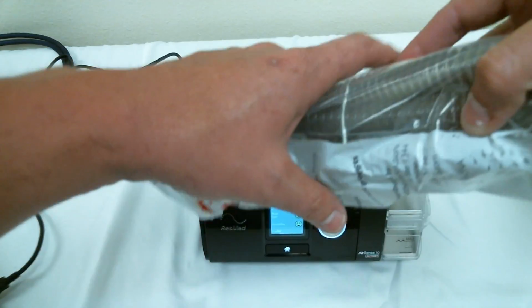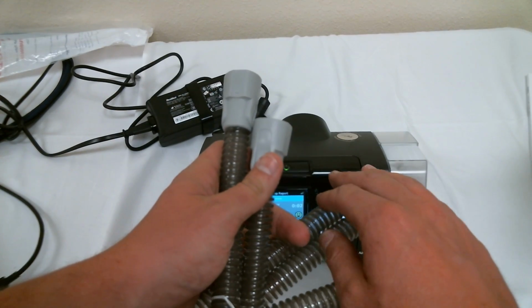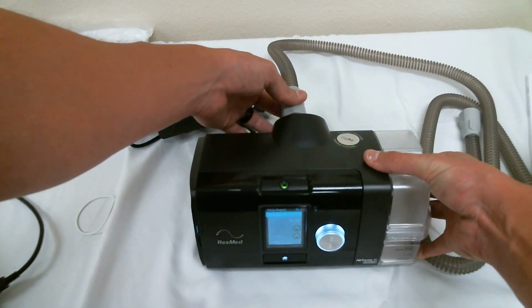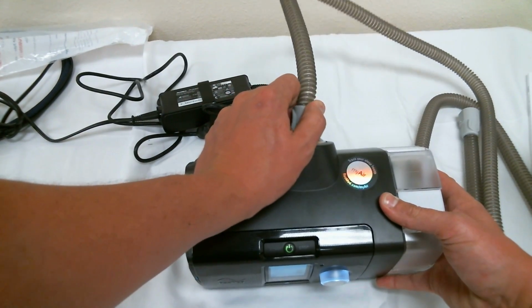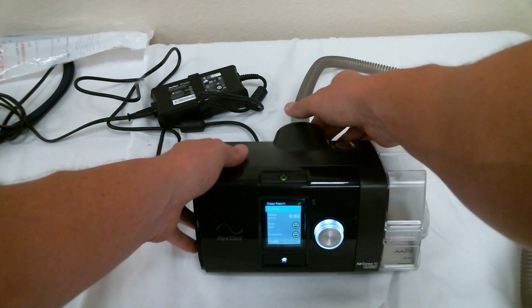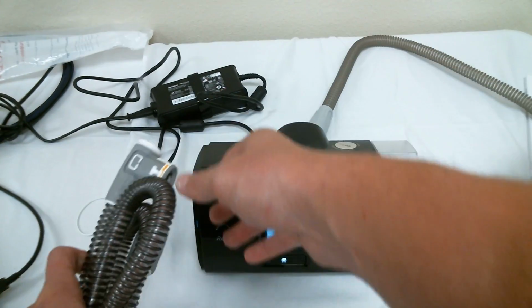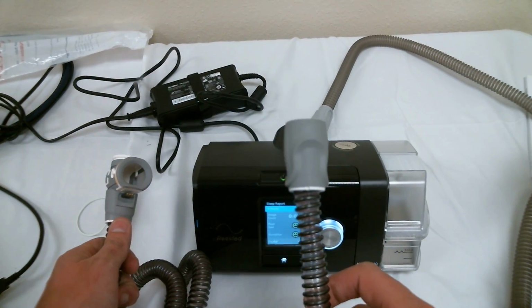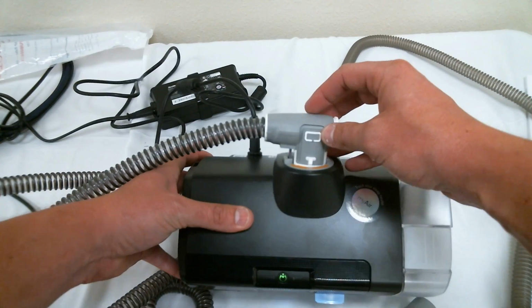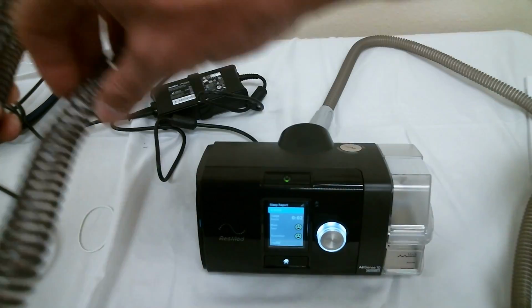Next, let's connect your tubing. Both ends of the tubing, if it's a standard tubing, should be the same. One end will plug directly to the back of your device, and the other end to your mask. If you have a climate line tube, such as this one here, you will have one end, the power supply, and one end that will connect to your mask. The power supply must be connected directly into the power plug, which is on the back of the machine, and clicks in. To remove, press the release buttons, and it comes right back off.